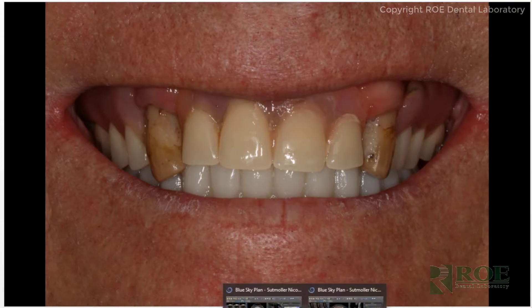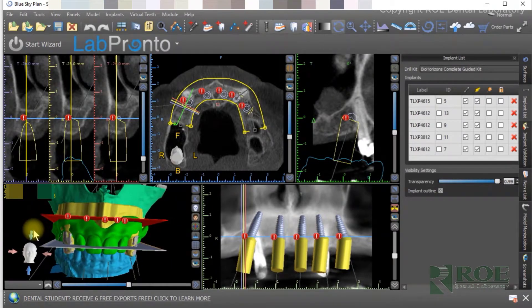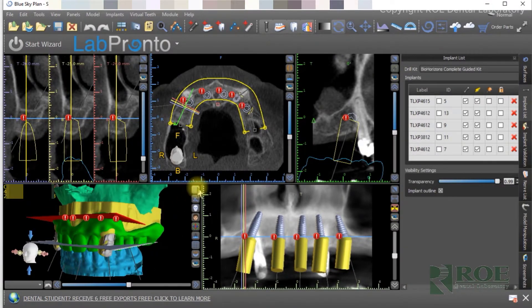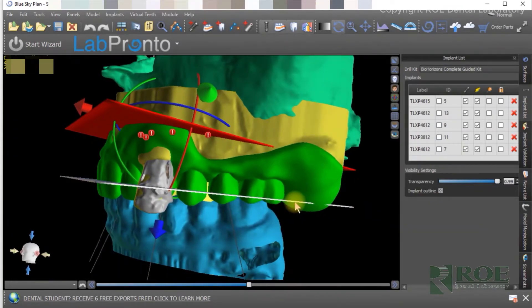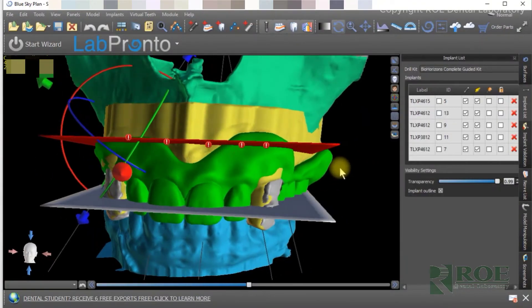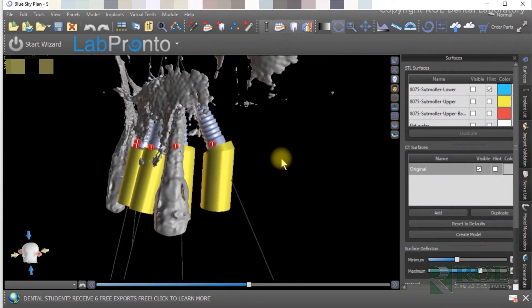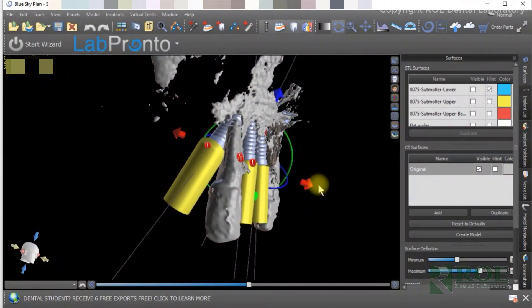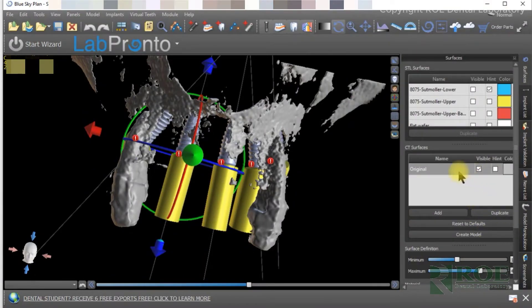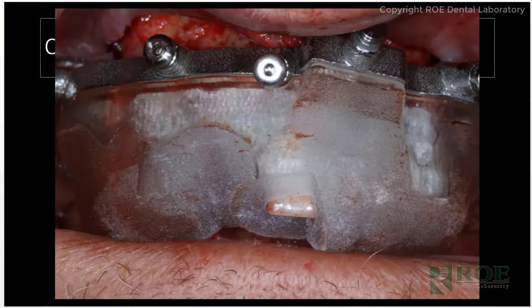A few months later, we received new records and moved forward with the maxillary case. Same planning process — implants, bone reduction, leveling, implant positions. This arch had a couple of angled implants and a little less bone to work with. Then we have a few images of the surgery for the maxillary arch.